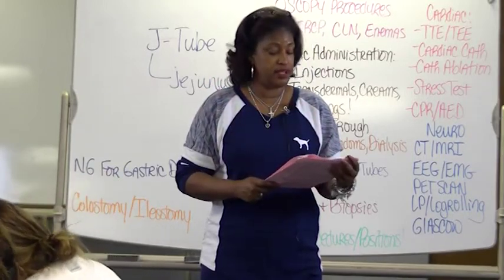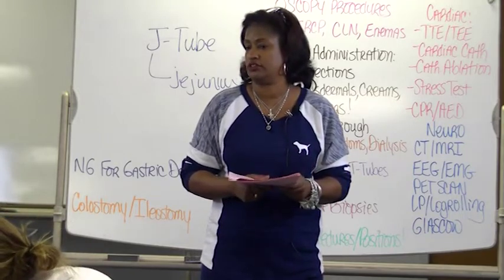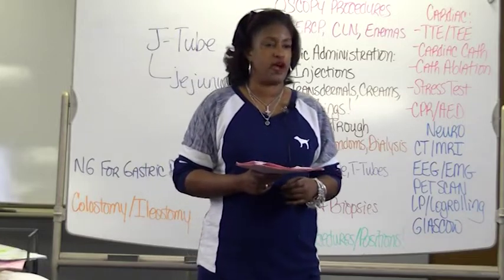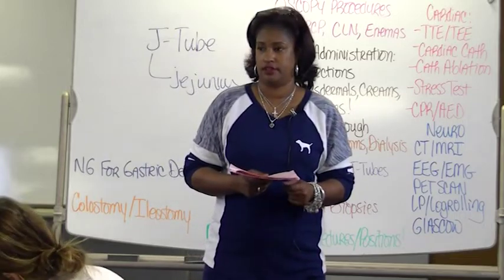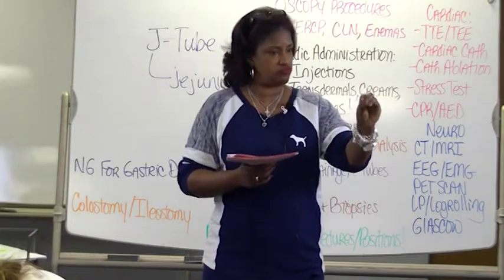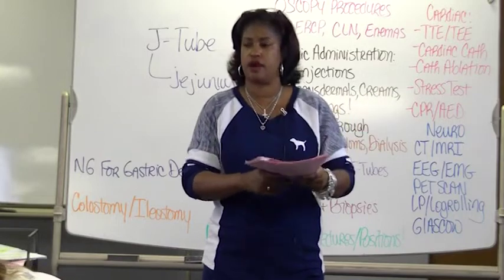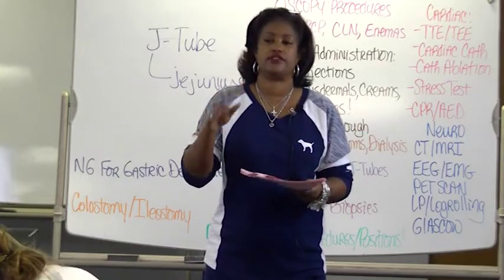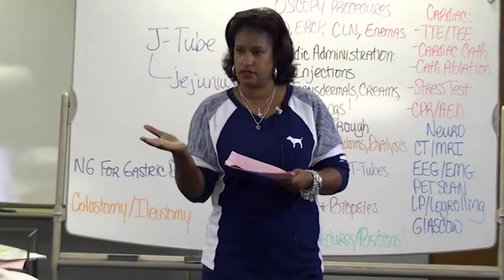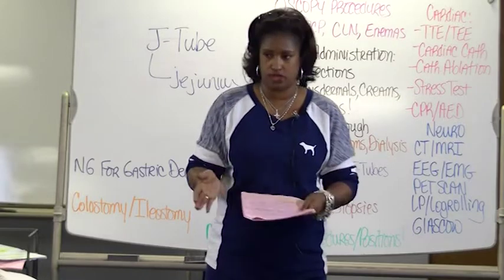And it's intermittent suction. And I want to emphasize it's gentle. You're not sucking the membrane off the stomach, okay? Please. Why is your suction up to 2,000? Just go on and just gentle. Little intermittent, gentle suction. You don't want to go crazy because here's why. You don't want to suck all the acid out, then you throw the patient into alkalosis. So it's gentle, intermittent gastric decompression.